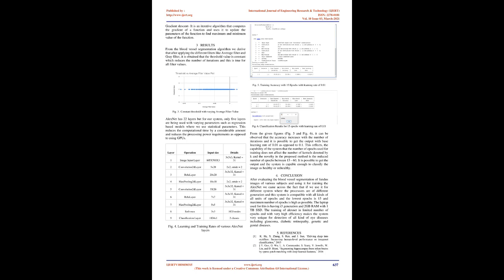The isodata segmentation is based on multispectral image processing, where a number of iterations is run based on the threshold which is calculated for each pixel of the image. The isodata segmentation is based on the physiological references based on the different channels of the image.